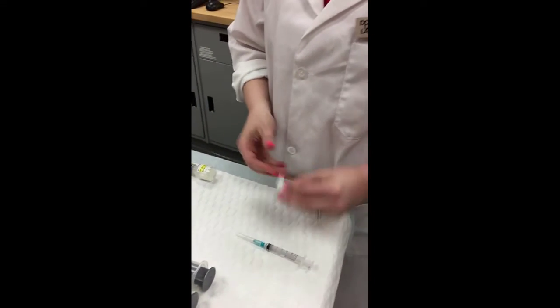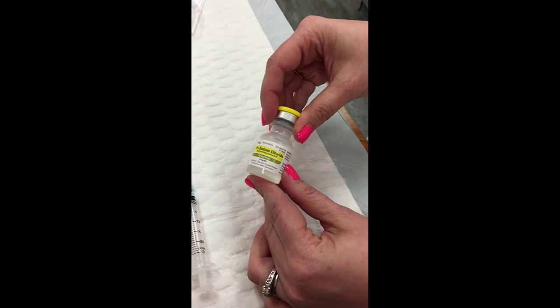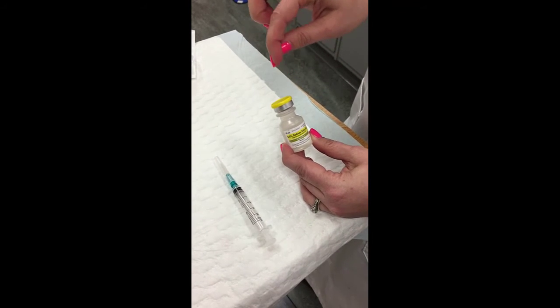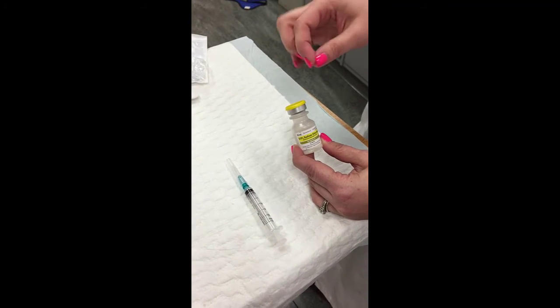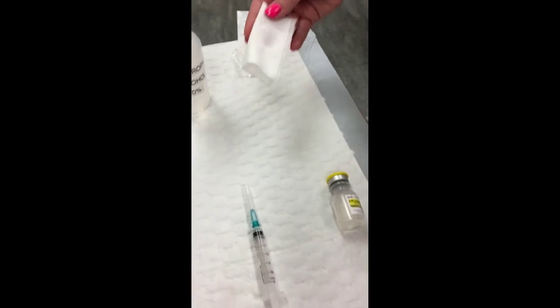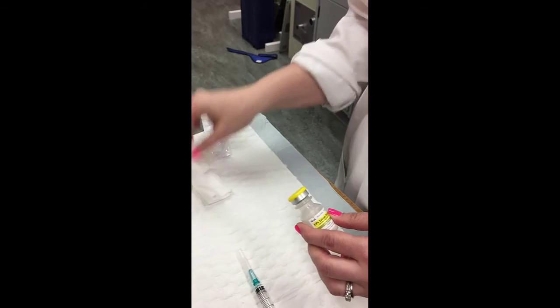Now, what I'm going to do is draw up my sodium chloride. Okay, it is a new vial, so what I can do is pop this cap off and the rubber stopper will be sterile. If it was a medication that is a multi-dose vial, what you will do is take a little bit of alcohol and put it on a gauze or a cotton swab, and once the rubber stopper is there, wipe the top of it just to prevent any contamination.